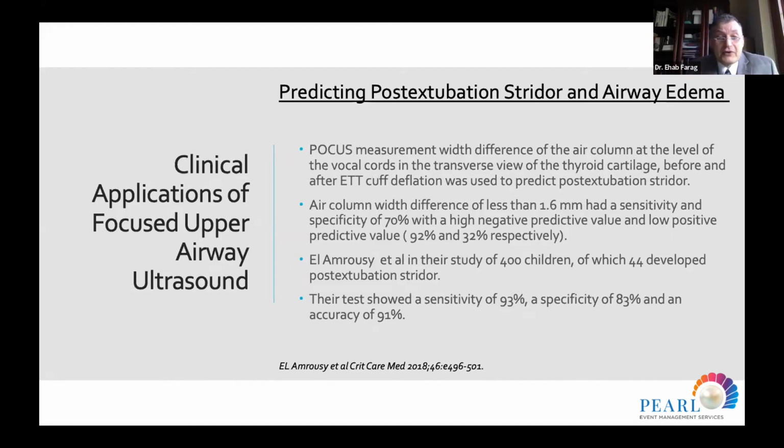Another group, Al-Marosi, confirmed that result. Ding et al. did that in 2006 in adults in the ICU, and Al-Marosi did that in children. They found that in 400 children, 44 developed post-extubation stridor, and they confirmed a test sensitivity of 93, specificity of 83, and accuracy of 91%.